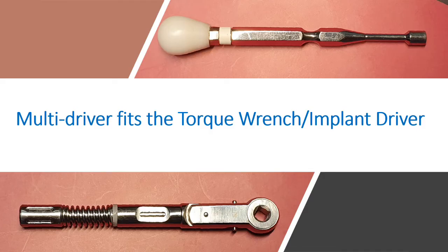These are our drivers and torque ratchets, and the implant driver is primarily used in the maxilla, and the torque ratchet will be used for inserting implants and for tightening up prosthetic screws to 40 Newton centimeters.